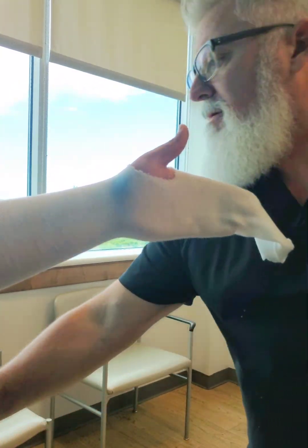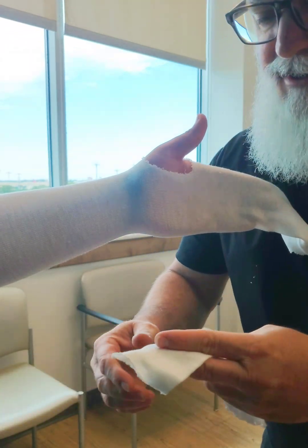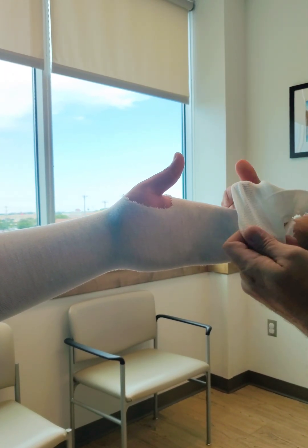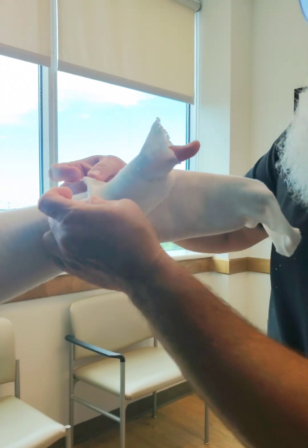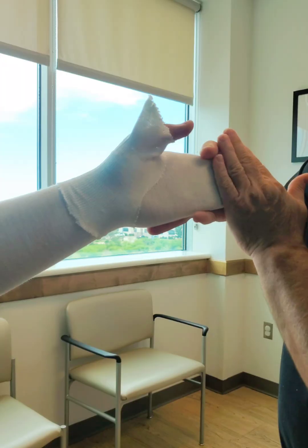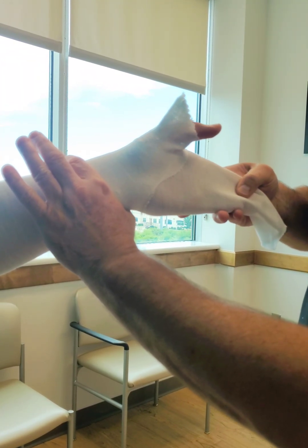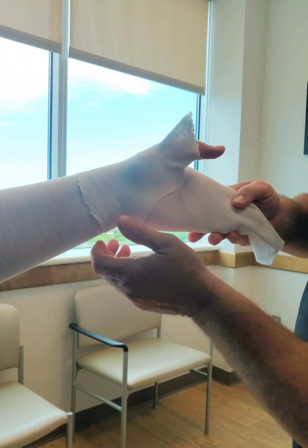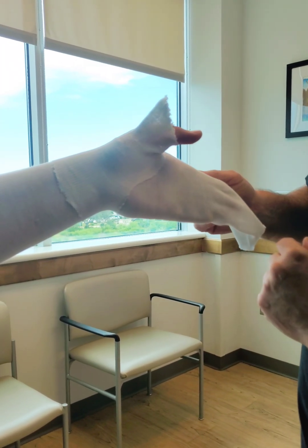And then we'll do the little thumb thing that you've seen us do a ton of times. I'm not going to do an entire video of wrapping, like you've seen in all the videos. What I want to emphasize at the stocking net and the beginning of the cast is you want to keep them nice and neutral, but start putting in the patient's head what you're going to try to do. That's kind of where the stocking net would go — we'll pause there and get the cotton ready.